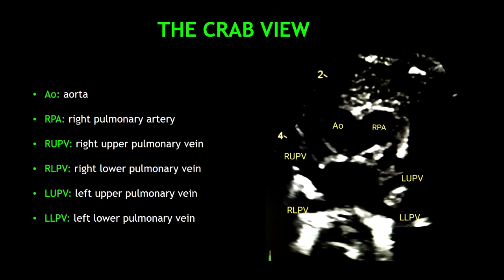In this image you can see all the structures visualized in this view. On the left side from top to bottom we have the aorta, the right upper pulmonary vein and the right lower pulmonary vein. On the right side from top to bottom we have the right pulmonary artery, the left upper pulmonary vein and the left lower pulmonary vein.